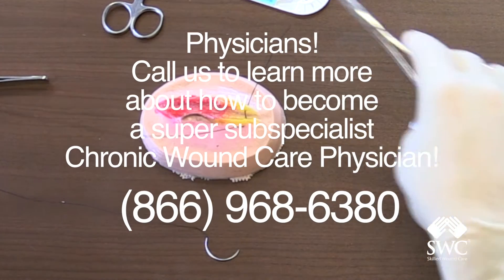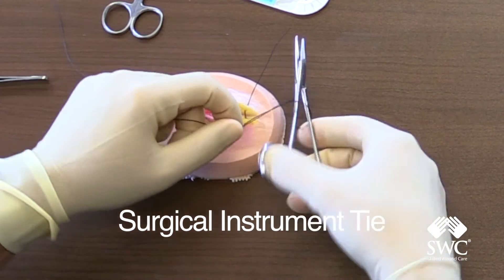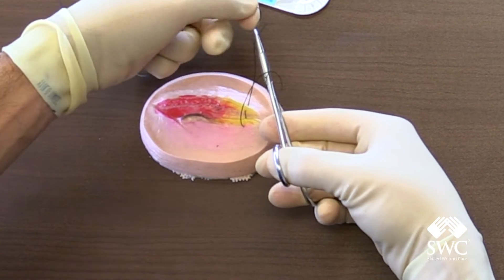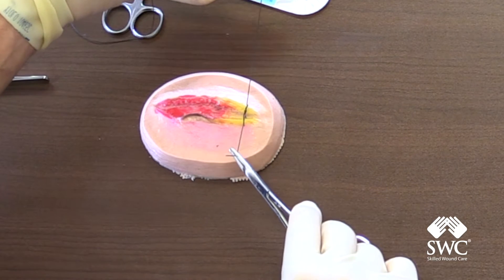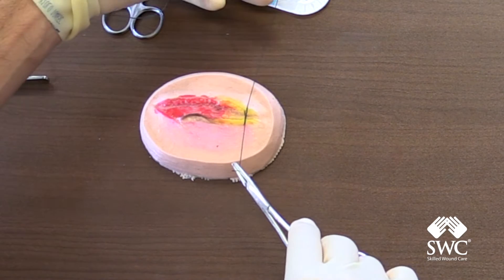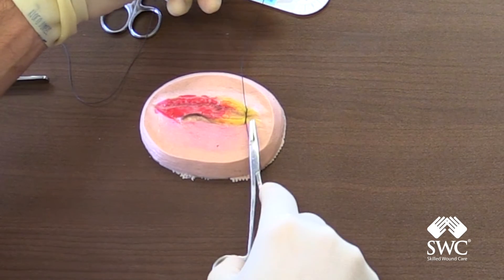You're going to have your tail, and usually the first part of the suture we do a double loop. Grab and then you want to practice being perpendicular to the tissue, because that's how you would do it in real life. And then look at that — that is a flat knot, because I rotated my hands opposite. If I would have went like this, the knot will not lay flat. Now the knot lays flat — you can see that it's flat.